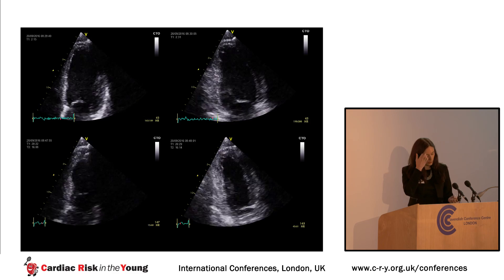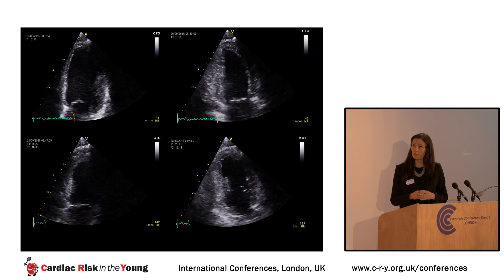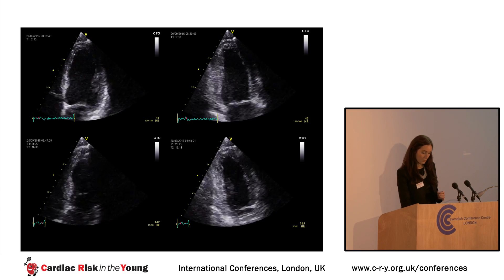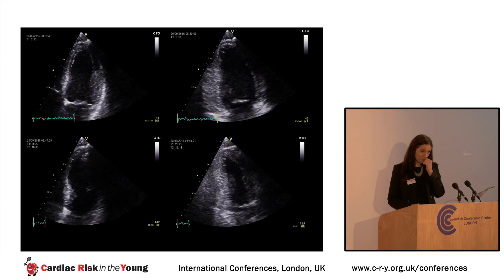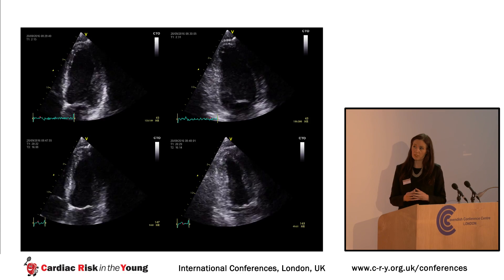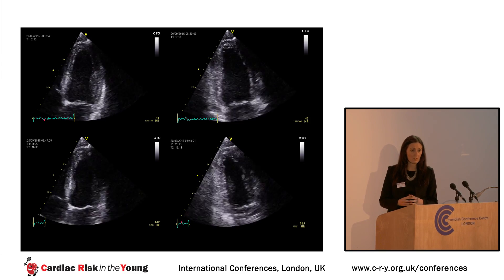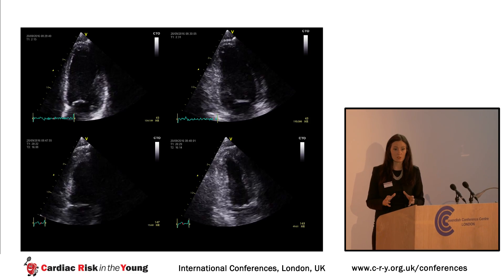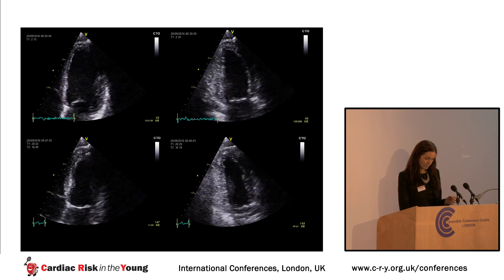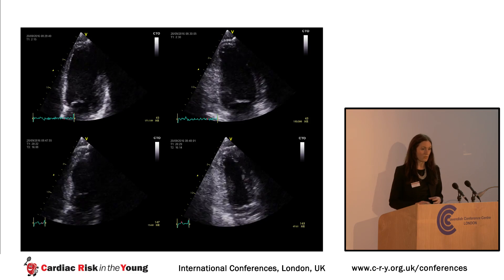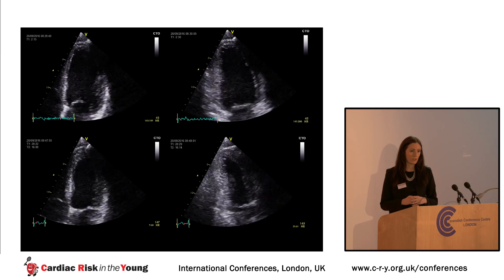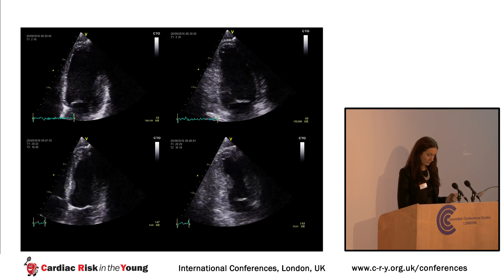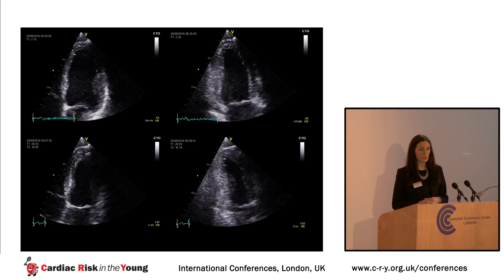This is an example of a UCI cyclist. You can see that at baseline on the four-chamber view, the ejection fraction looks at the borderline level. But when we exercise them, you can see clearly that in both the four- and two-chamber views, the left ventricular cavity dimensions decrease both in systole and diastole, with an improvement in ejection fraction from around 50% to about 70% at peak exercise. This is in contrast to a patient with very mild dilated cardiomyopathy with a similar baseline ejection fraction of 45% to 50% — in that case, the LV function doesn't really improve or change.